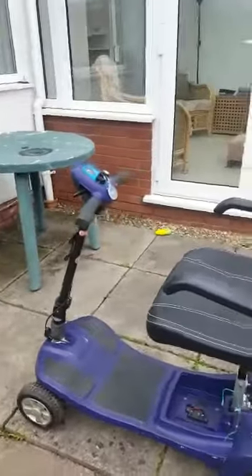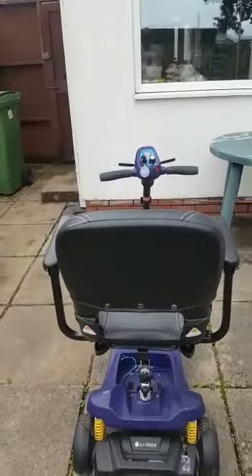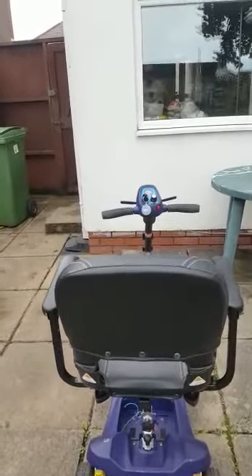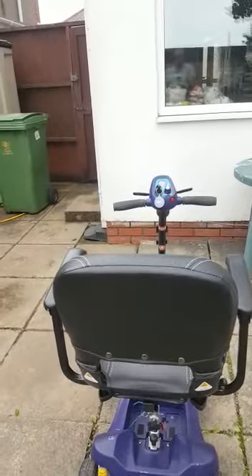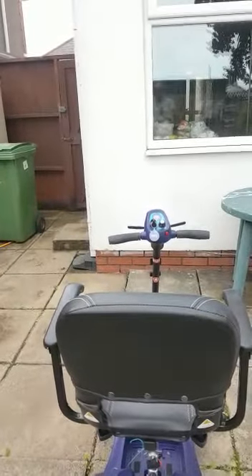Secondly, if I look at the scooter straight on, even though it's in straight alignment, the handlebars are slightly to the left. This is because the undercarriage has at some initial point damaged itself somehow. And so basically, if you try to drive this in a straight line, it will go in circles.